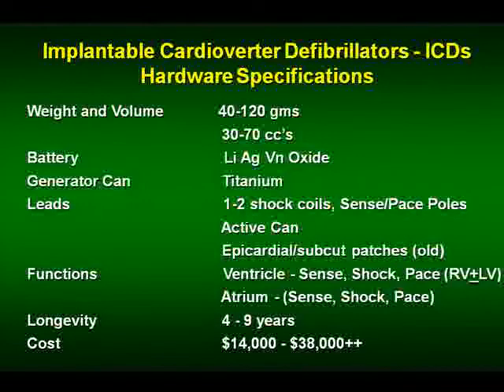Their function is they can sense, pace, and shock. They can sense, pace, and rarely shock in the atrium. The devices are supposed to last 4 to 9 years, but it's a function of how much you use them, and they are wildly expensive. This is just the list price for a defibrillator.